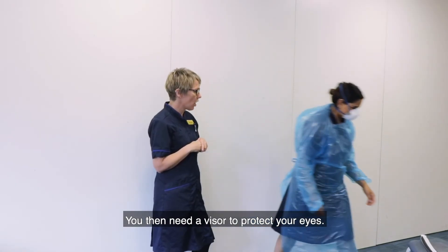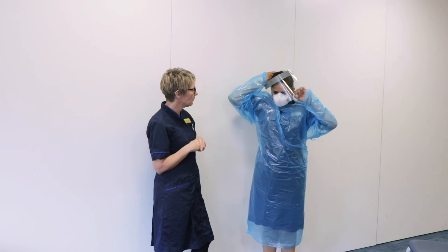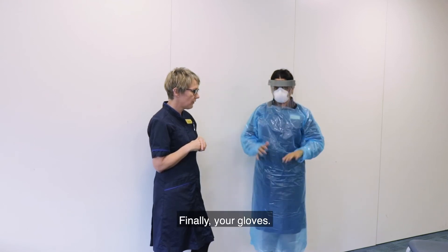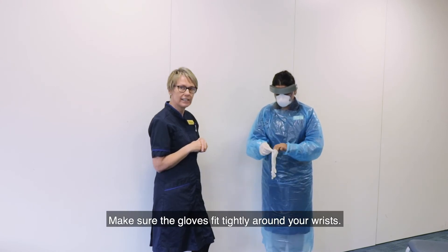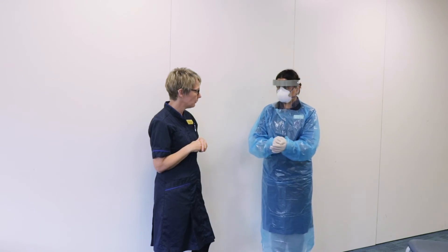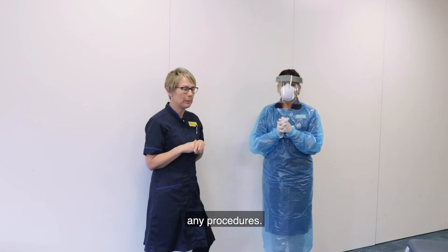You then need a visor to protect your eyes. The foam strap of the visor should sit on your forehead — please make sure it's correctly fitted. Finally, your gloves. Make sure the gloves fit tightly around your wrists and are fully secured. Before you go into the room, please ask a colleague to check that all of your PPE is on correctly and that you're safe to enter the room before undertaking any procedures.